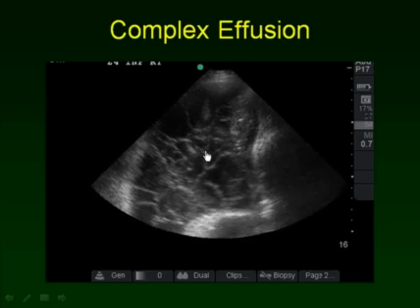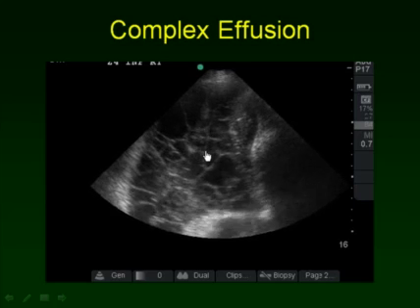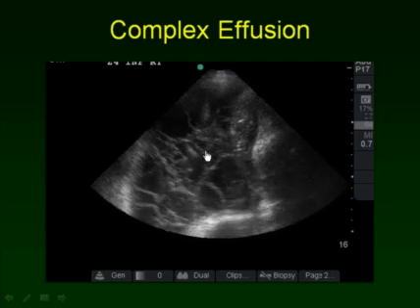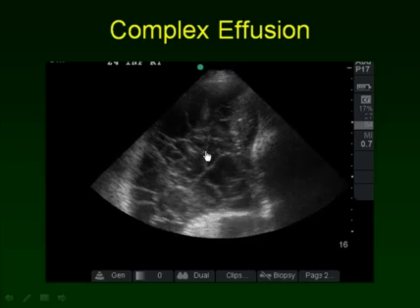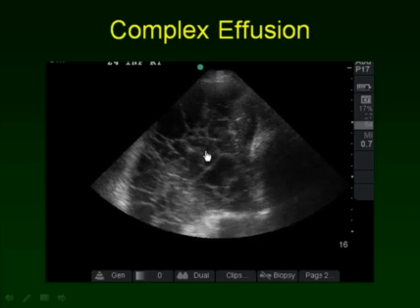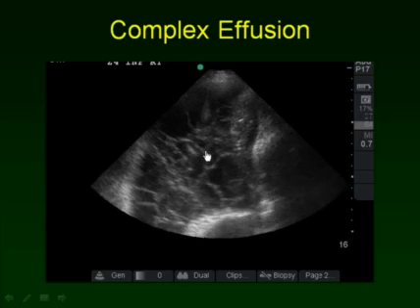This is subpulmonic in location. And in scanning this, this is very likely going to require insertion of a larger device, followed by thrombolytics, if that's the philosophy of the clinician, or followed perhaps by the necessity for surgical intervention, if that's the philosophy of the clinician.